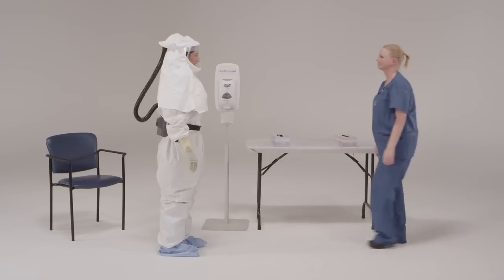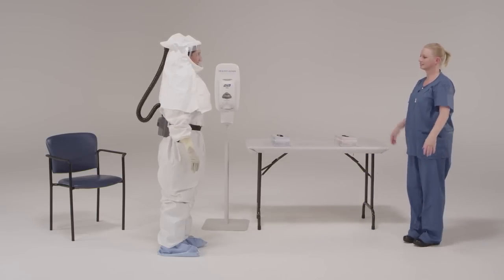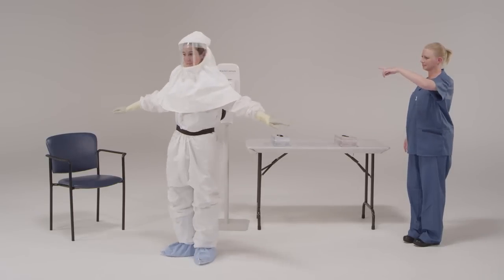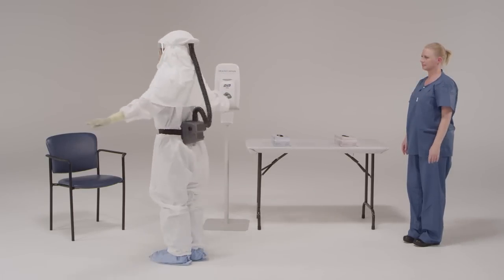The health care provider should be comfortable and able to extend the arms, bend at the waist, and go through a range of motions to ensure there is sufficient range of movement while all areas of the body remain covered.